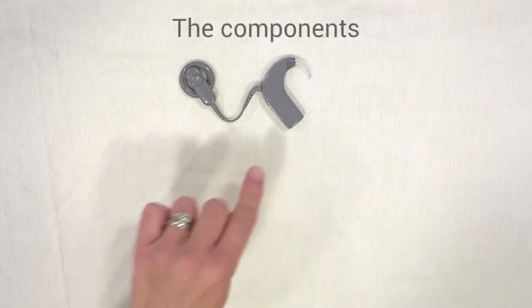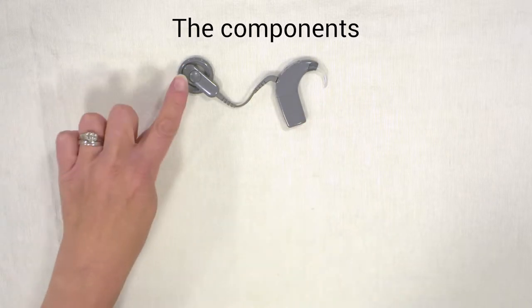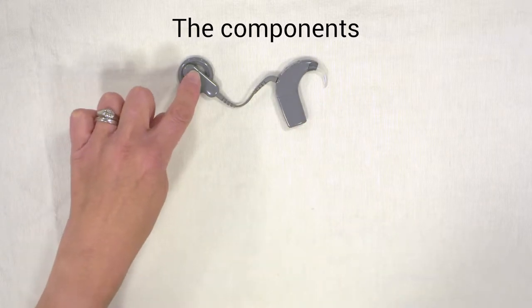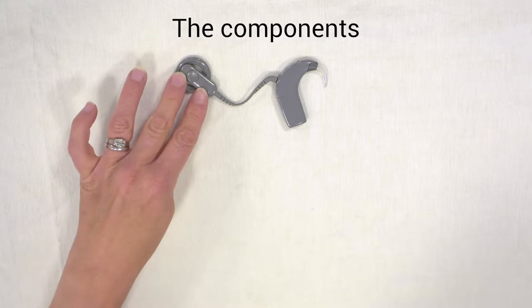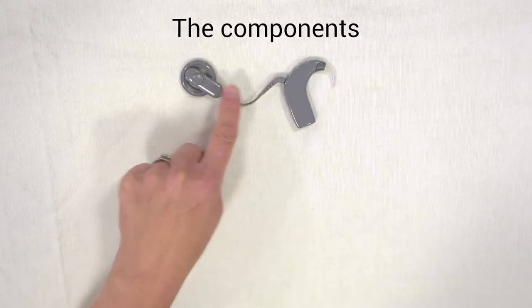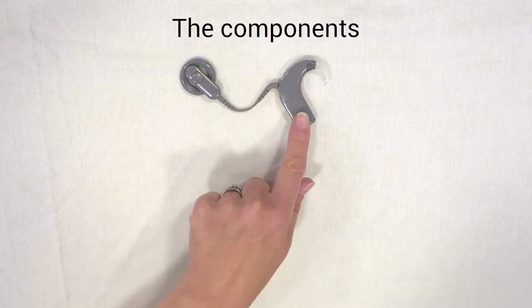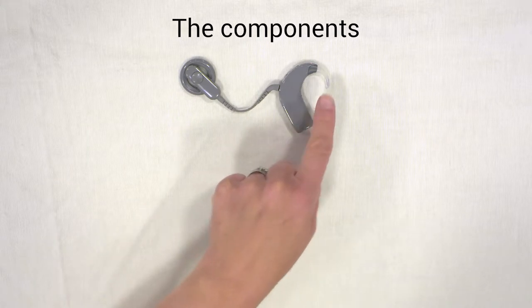First, I'll tell you the names of each of the pieces that make up the processor. You have the coil with a magnet in it, and this is what transmits the signal across the skin. You've then got a lead that connects the coil to the processing unit. The processing unit then has a battery and an earhook.